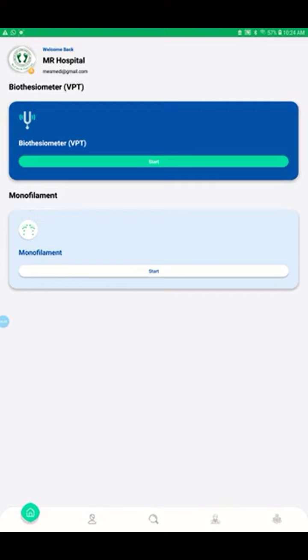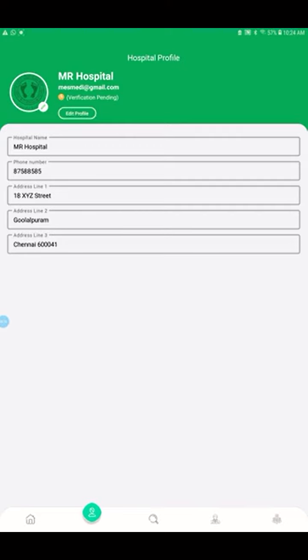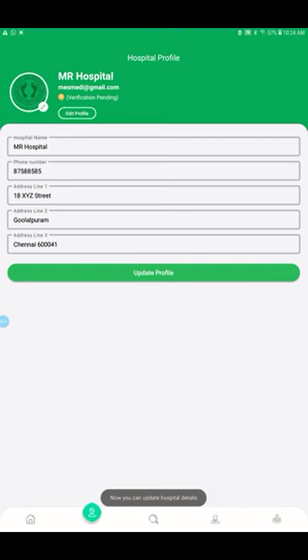Here you can see the biothesiometer icon is there, bottom monofilament. On the top you can see hospital name and hospital email ID is there. Bottom you can see a few keys are there. First is the home. Second, if you select, it gives the hospital details. If I want to change the logo, I can update the hospital information by selecting the edit button. You can change it with a different logo, and the hospital name, everything can be updated. Since I did not change, it says nothing changed.